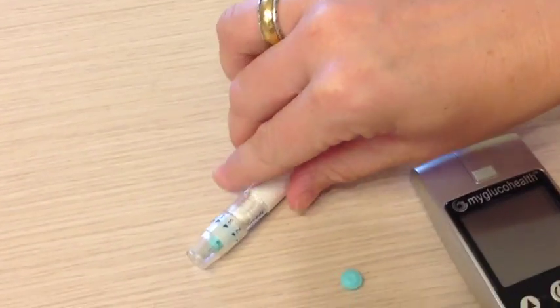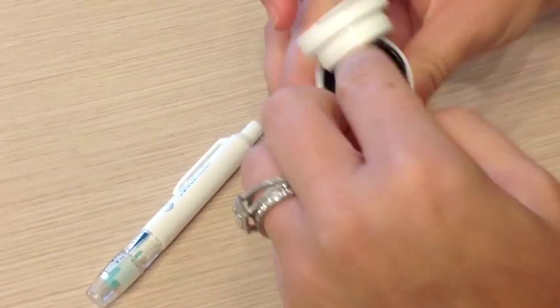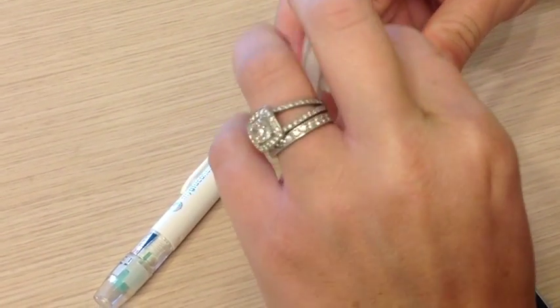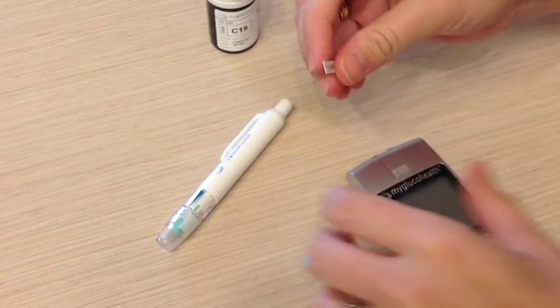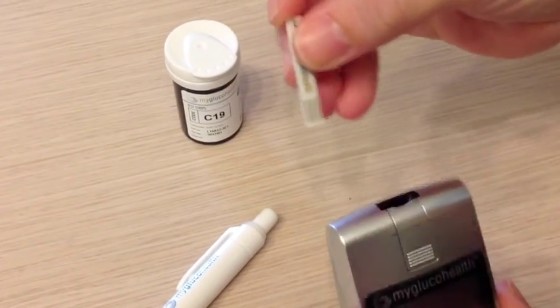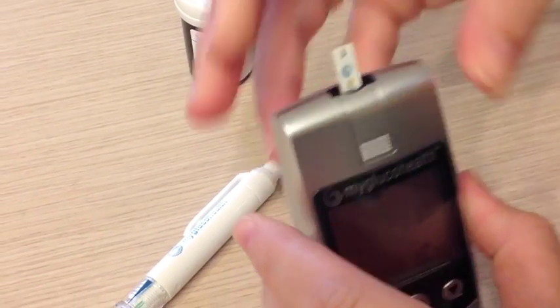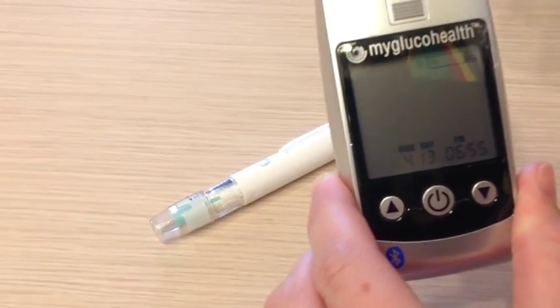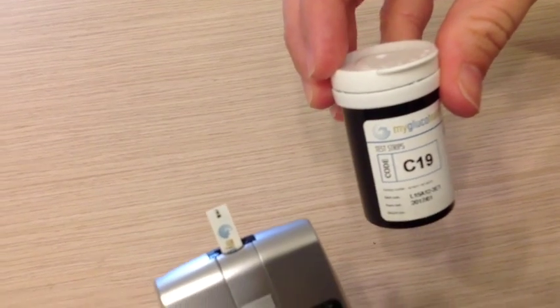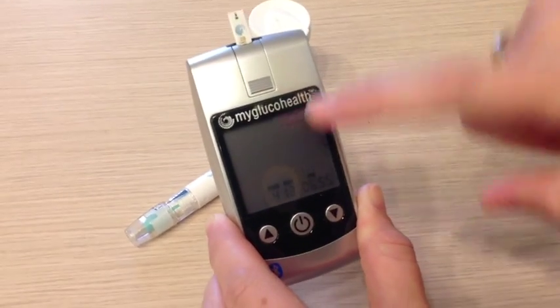The next step is to take out your strip. This is pretty standard as far as checking your blood sugar goes. Make sure that you put this side right here facing forward down into the meter, and the meter will automatically turn on. This code, C19, should match what is on the bottle of strips, just to make sure that it's going to work.